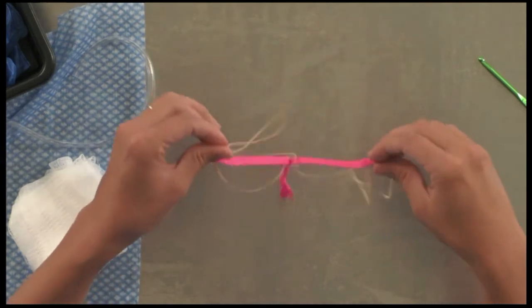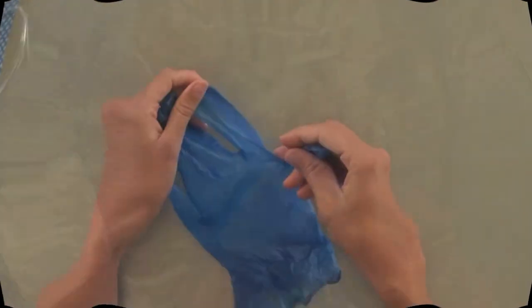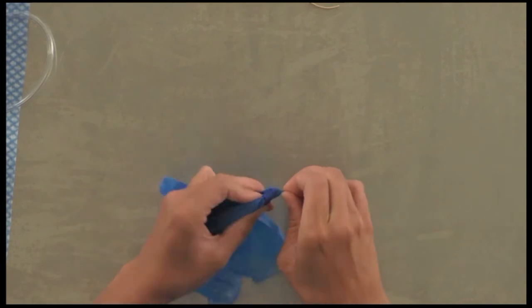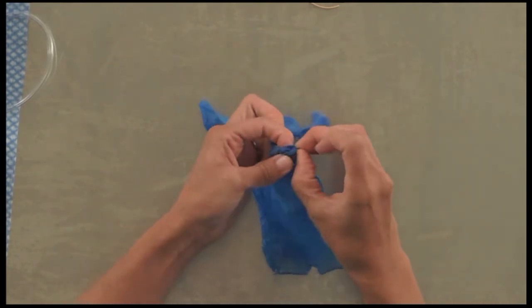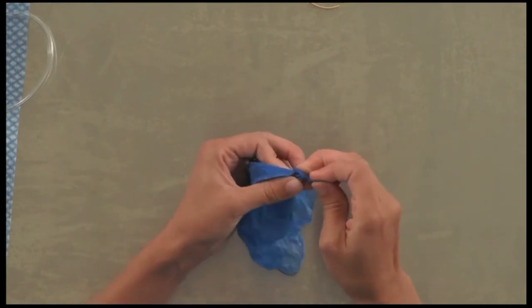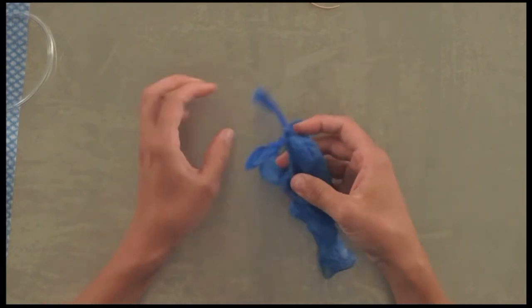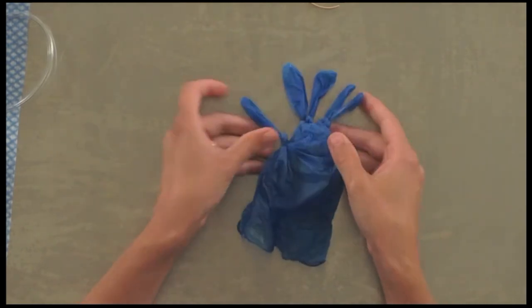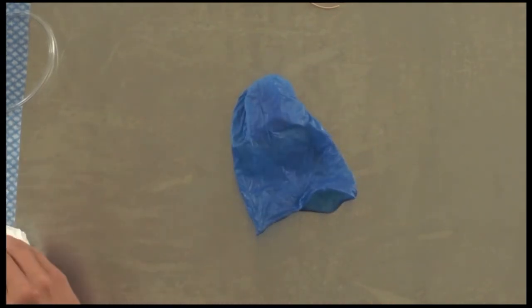Next, take your glove and tie a knot in each finger at the base — we'll make our bladder out of this. It takes a little bit of time but you'll get there. Once done, flip the glove inside out — that's your bladder.